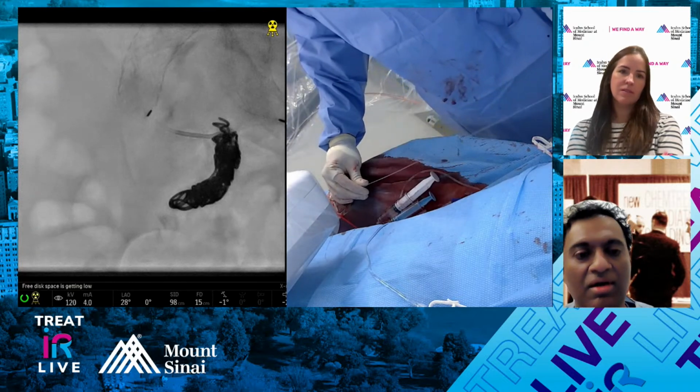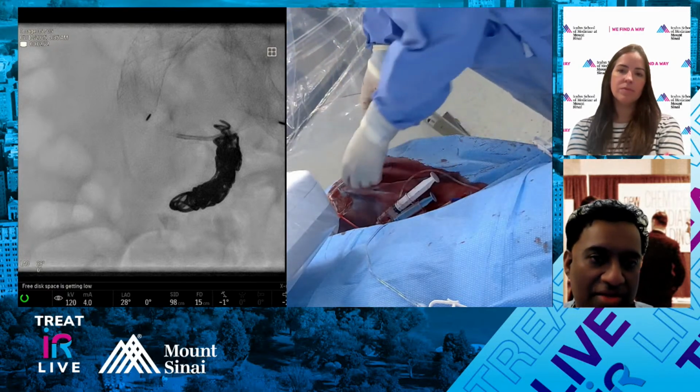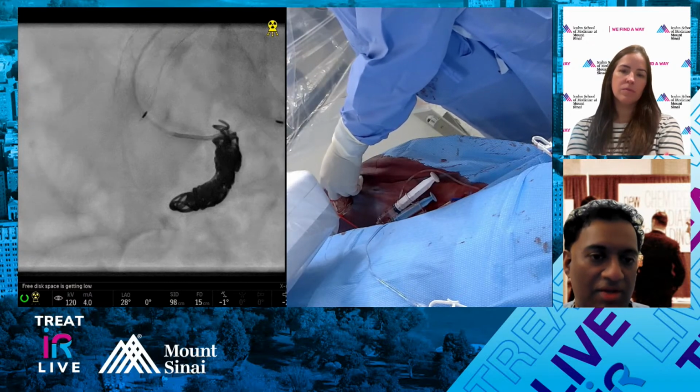That was a multi-branch embolization. But in this case, that one packed really nicely. One thing you could do, say in this case, is say you wanted to go ipsilateral and femoral. I mean, radial would be a little tricky. You could put an RTP sheath and try to plug.